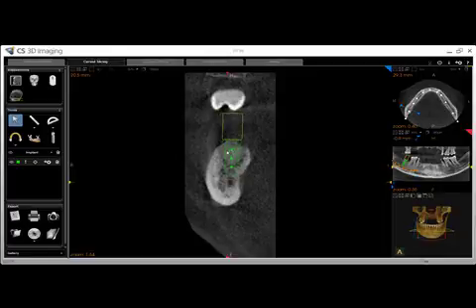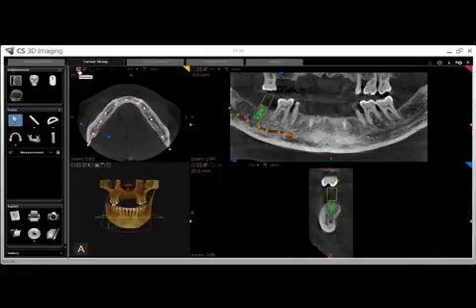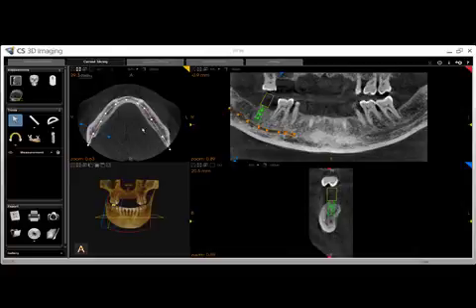You may also use the measurement tool for appropriate measurements. Once you are happy with your initial positioning, you can click minimize to come back out of full screen.